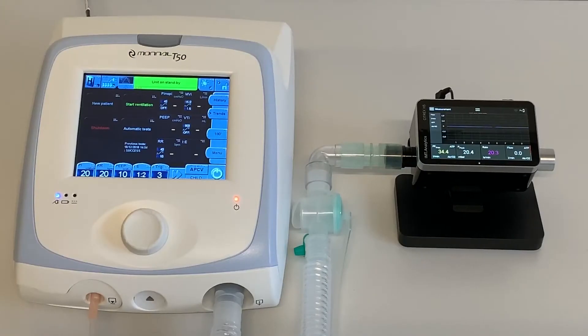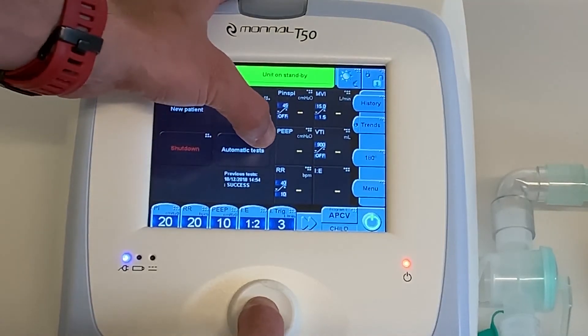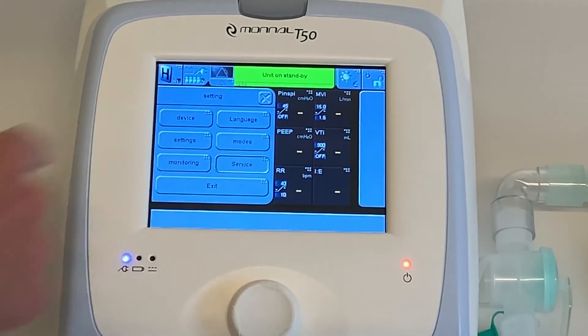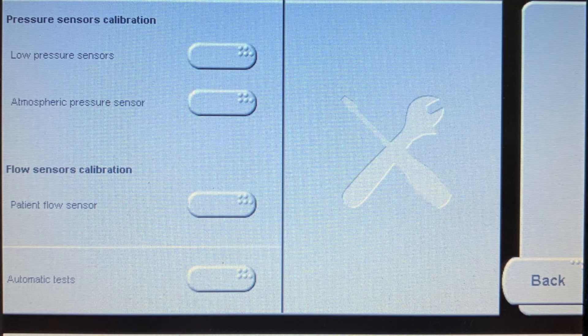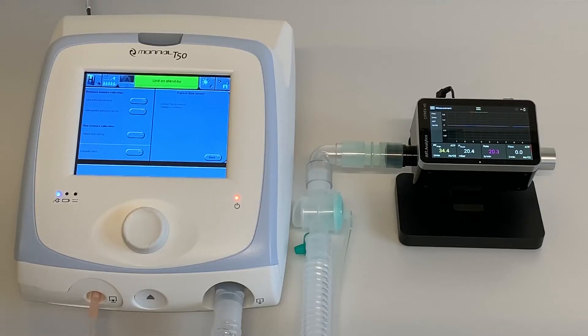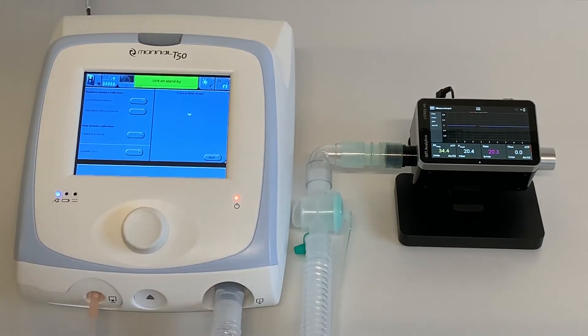The first measurement we do is flow sensor calibration. Press and hold the control knob and press the automatic test button on the screen. Select Service, then select Calibration. Select Patient Flow Sensor under Flow Sensor Calibration. Verify the Citrex H5 is connected, then press the control knob to confirm. Follow the instructions on the screen.